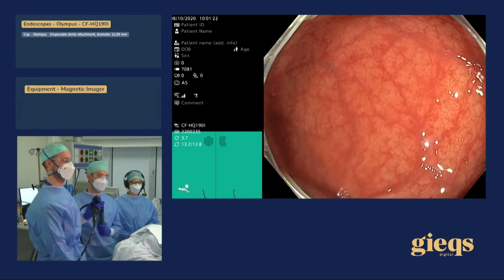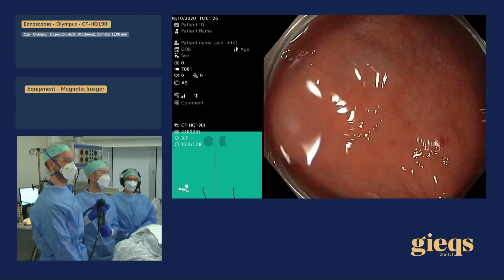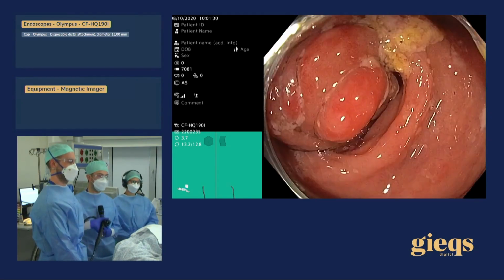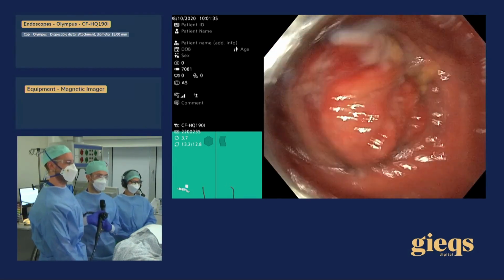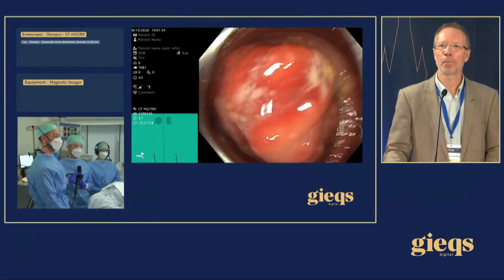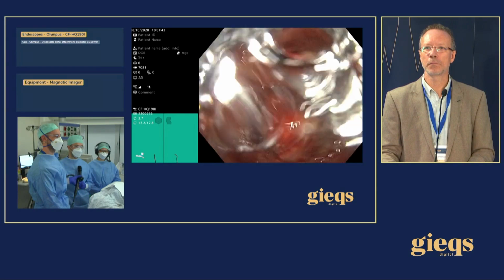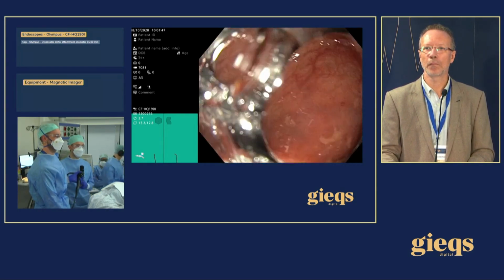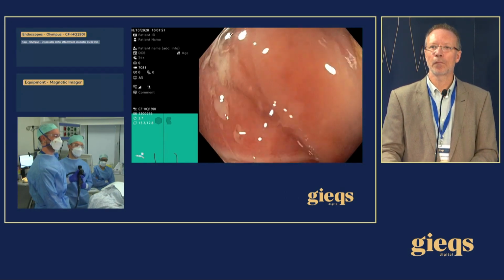All right, so we start in the rectum here, and take the first turn. And we immediately saw we had to take a good look first, but this gentleman has some diverticula here, and we think this is going to expand the lumen a bit, insufflating some carbon dioxide with some mucosal prolapse. So you've got a cap on the scope, Christophe. Yeah. That makes it wider.